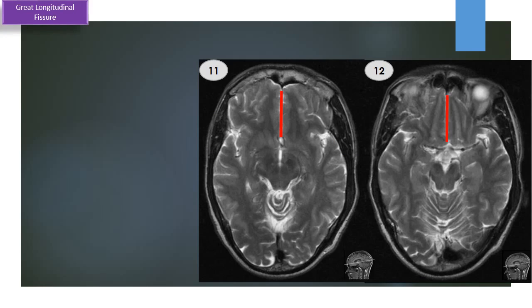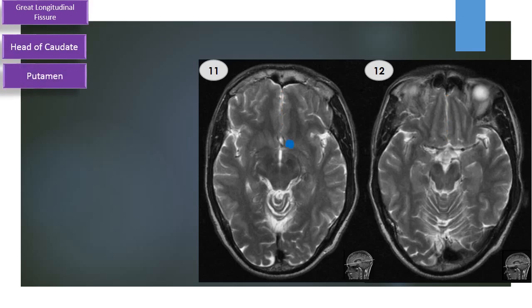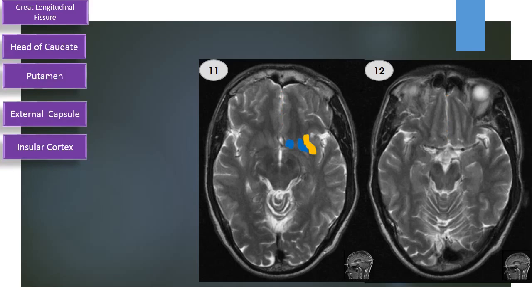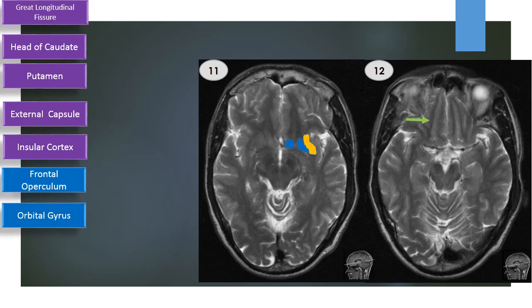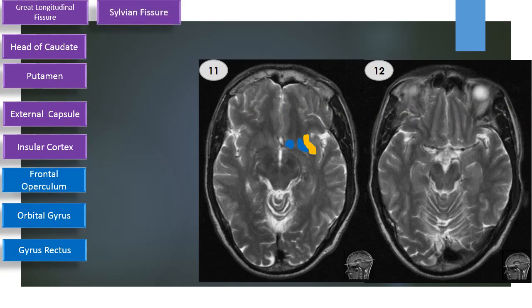Great longitudinal fissure. Head of caudate nucleus. Putamen. External capsule. Insular cortex. Frontal operculum. Orbital gyrus. Gyrus rectus. Sylvian fissure.